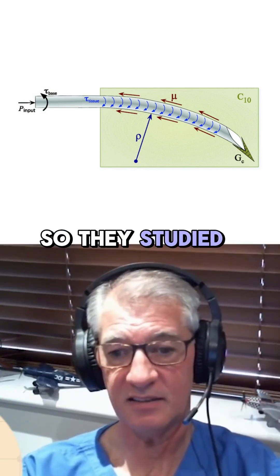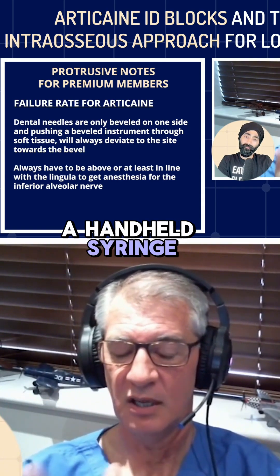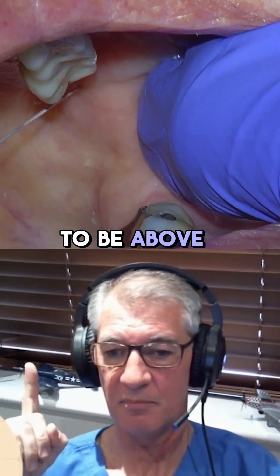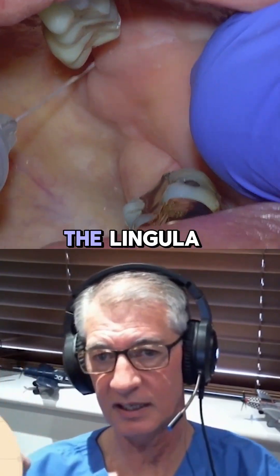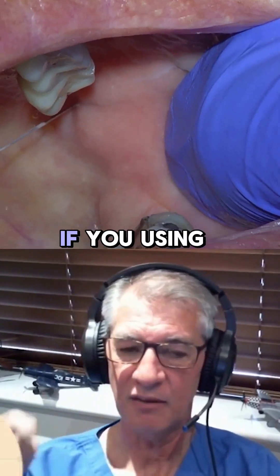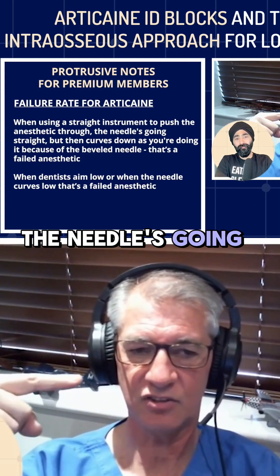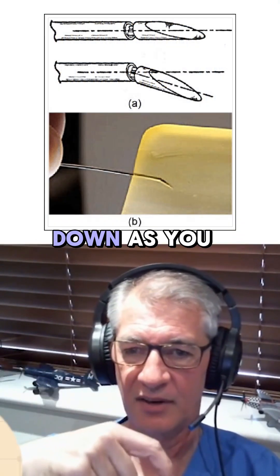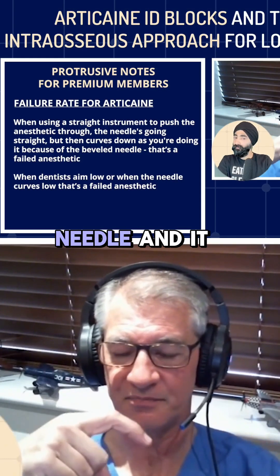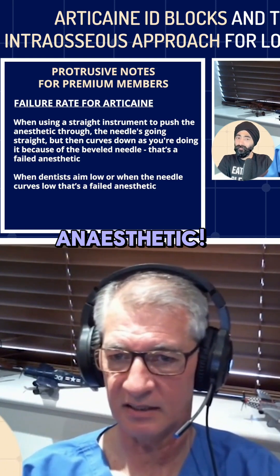They studied this, and what it means is that when you're holding a handheld syringe and aiming for the lingula — because you always have to be above or at least in line with the lingula to get anesthesia for the inferior alveolar nerve — if you're using a straight instrument aimed straight, the needle can curve down as you're doing it. There are x-rays showing this curved needle dipping below the lingula, and that's a failed anesthetic.